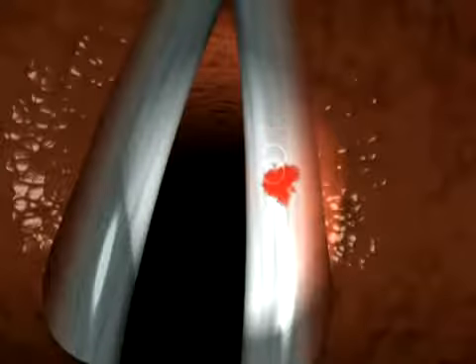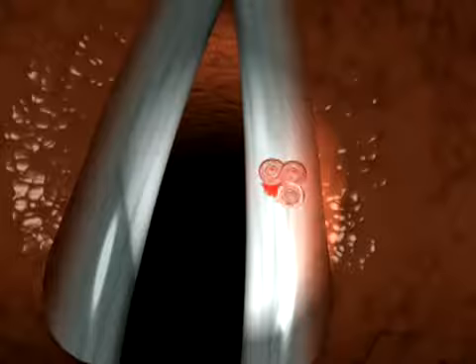So it's a great laser to do photoablative work for recurrent respiratory papillomatosis, especially as you get close to the human vocal fold, or treating the superficial spreading variety of papillomatosis, where scanning that papilloma as it spreads out on the vocal fold, the ventricle, the false vocal fold, or the subglottis, allows you to literally photoablate layer by layer by layer. And it's just exquisitely precise.